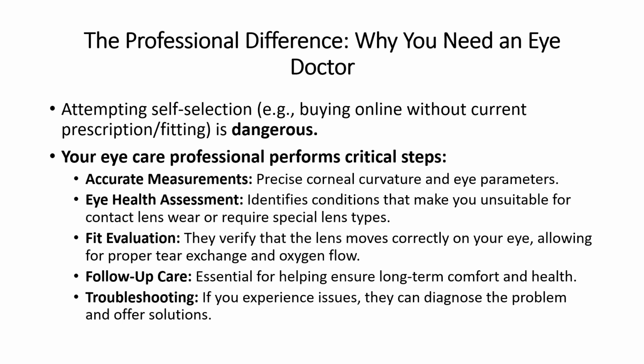Only an eye doctor can take the precise measurements of your corneal curvature and other vital eye parameters necessary for a proper fit. They conduct a thorough eye health assessment to identify any underlying conditions that might make you unsuitable for contact lens wear or require a special lens type. They also carefully evaluate the lens fit on your eye, verifying that the lens moves correctly, allowing for proper tear exchange and adequate oxygen flow to your cornea.